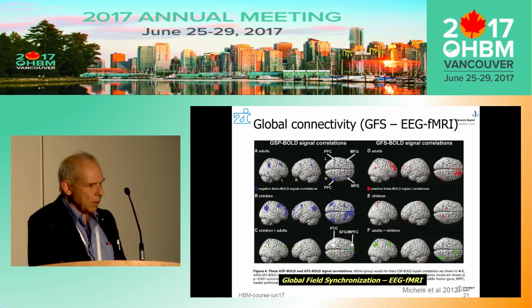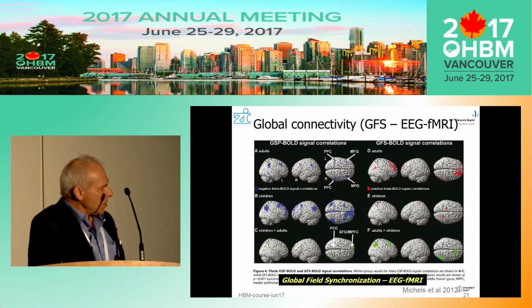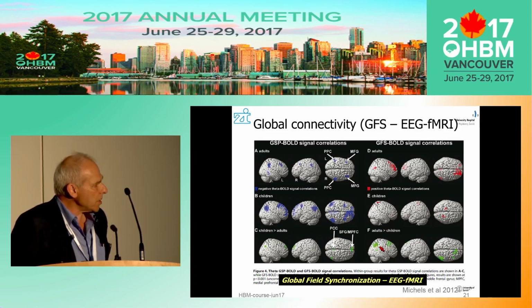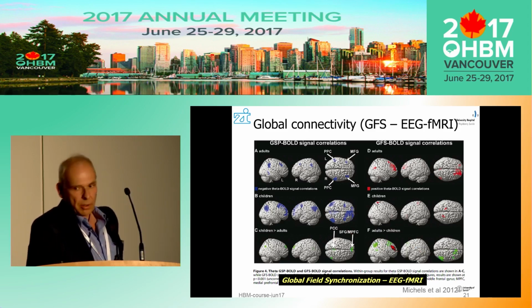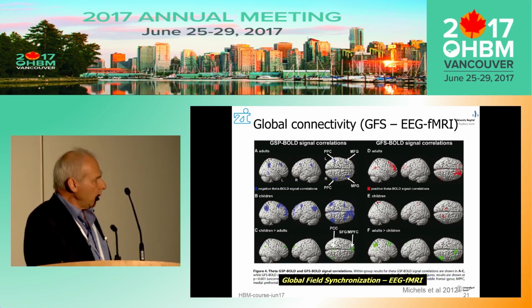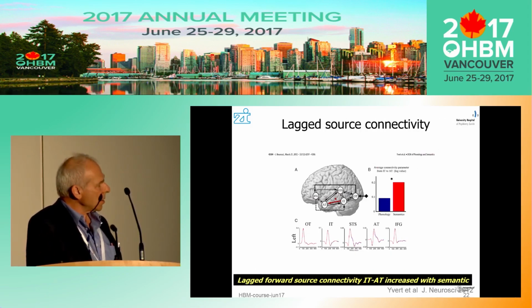And if you look at regional aspects, that's not EEG source localization, but that's a BOLD correlate of these working memory load effects, then what you can see is that global field synchronization really has a very meaningful correlate, namely it identifies the development of the working memory network, the frontoparietal working memory network, and it identifies that better, more precisely, and with more significance than just the spectral power, which is conventionally done in such analysis.